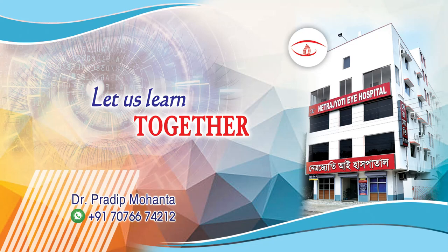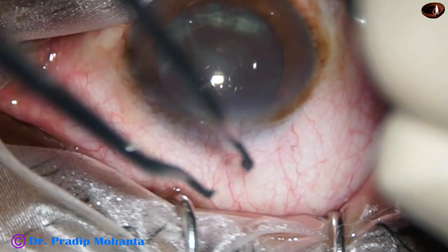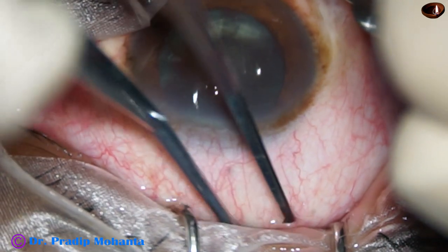Welcome to my workplace at Ranaghat, West Bengal, India. This video is for teaching SICS, that is, Small Incision Cataract Surgery.